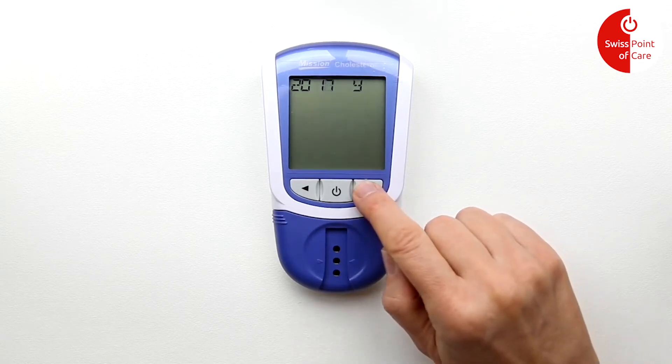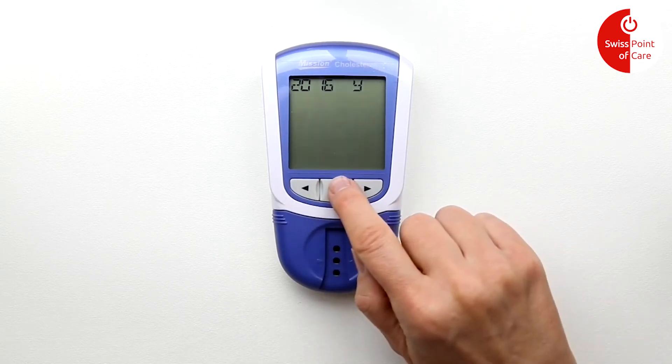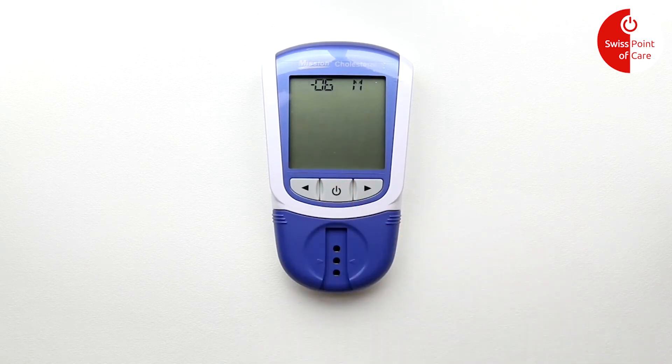Use the arrows to set the correct year. Then press the on/off button again to save and continue.